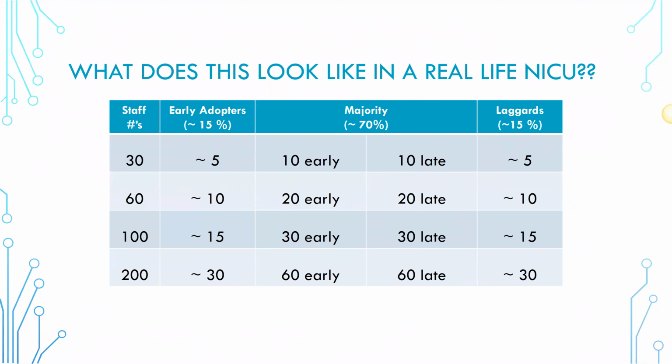So you have to intentionally place that extra lead if you want to pick them up specifically over the parietal. And when we do our full EEGs, I always recommend that our techs put on that extra parietal channel for us. But you can see that the central is a really high yield, and so if you're only putting on a couple electrodes, then you want to be in that spot where you can definitely pick up those seizures. And most neonatal seizures, even if they originate in another place, tend to generalize through that central zone as well.